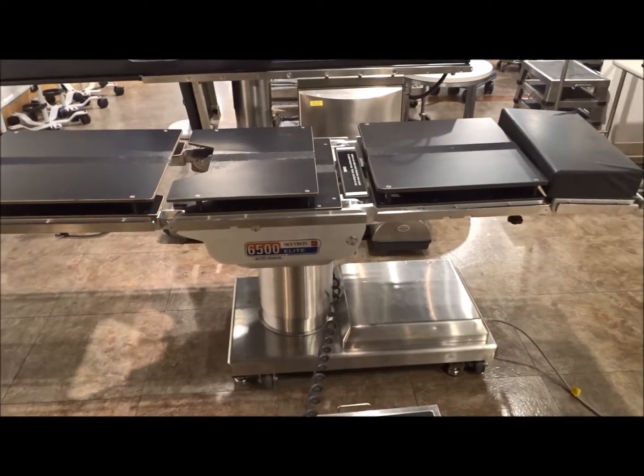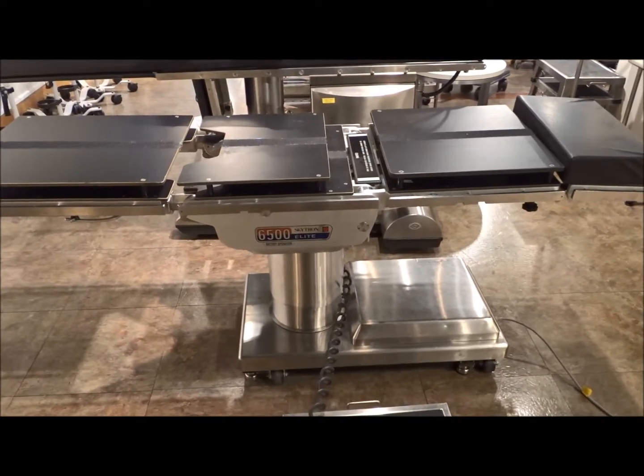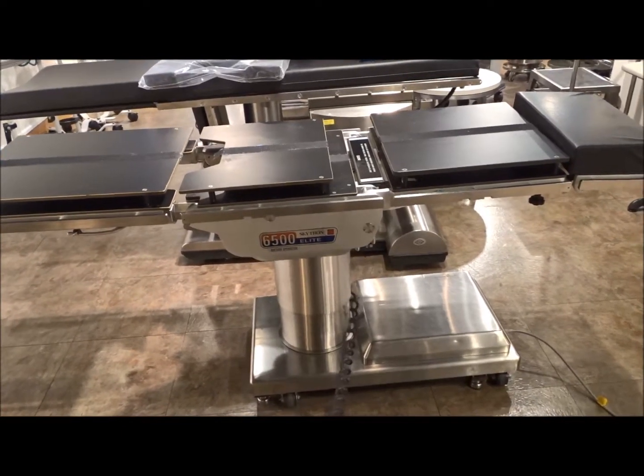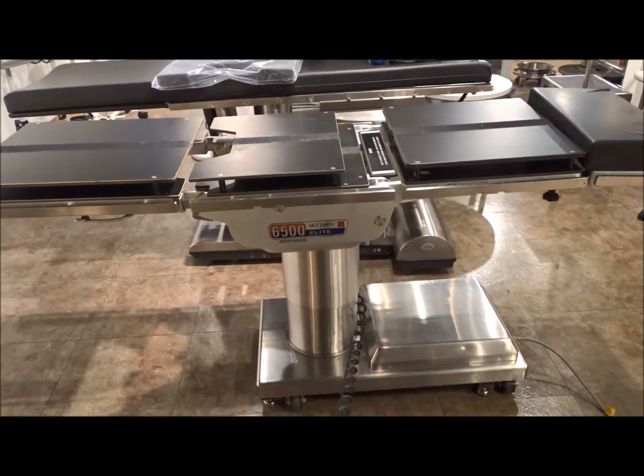Now when you're buying a surgical table — an OR, operating room table — they're going to come patient ready, they're going to come out with brand new pads, and they're going to be biomed tested, certified, and ready to go into service. As you can see right now, when the table moves, it's a very quiet table.